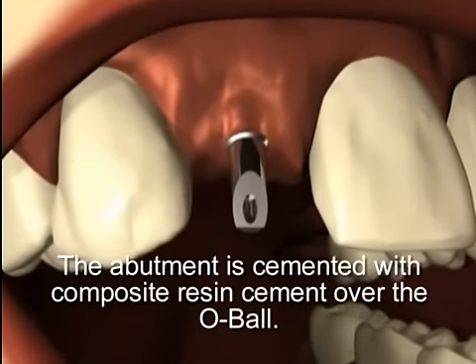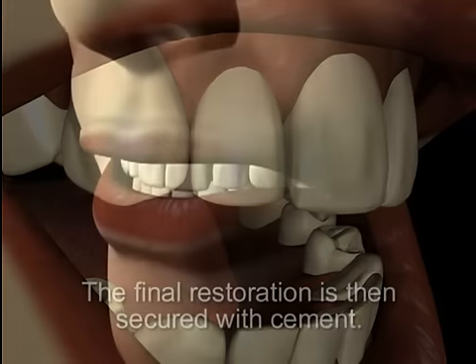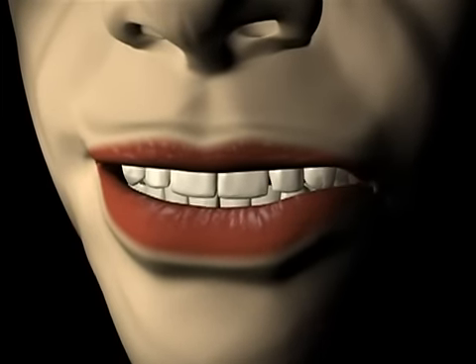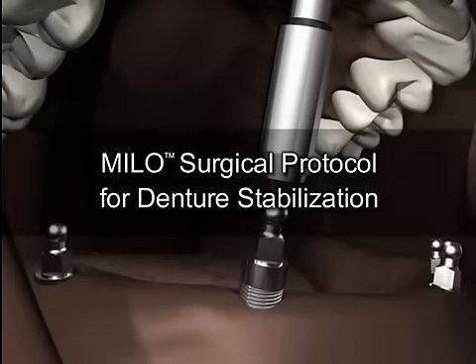Only a resin cement is acceptable. The final restoration is then placed, and the fit, aesthetics, and proper occlusion are confirmed, both visually and radiographically. Upon confirmation of all parameters, the restoration is secured with cement. The following sequences demonstrate MILO's surgical and restorative overdenture protocols.